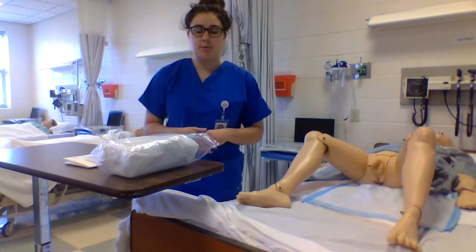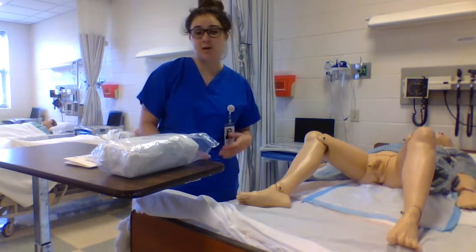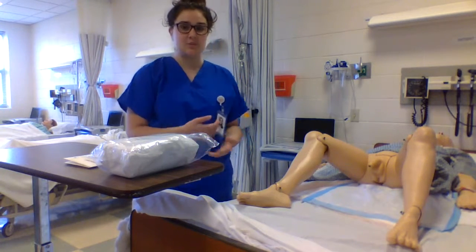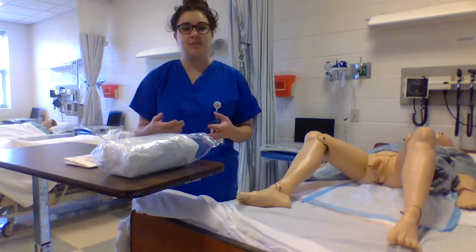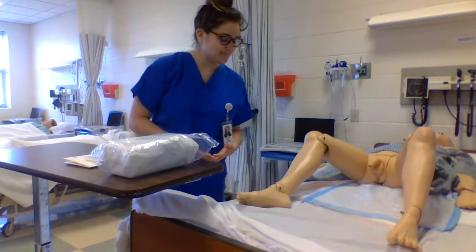Upon completion, I'm going to lower the bed, apply side rails or lower side rails according to care plan, and place call light system within reach. And then if any abnormal findings, I'm going to immediately report those to my charge nurse.